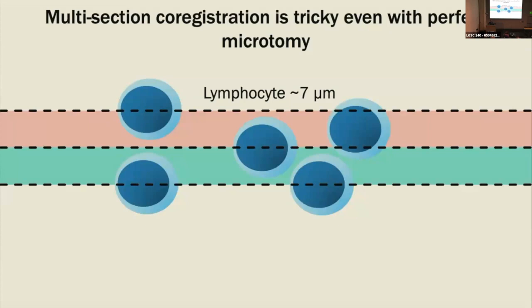Yeah, that's an interesting question. I don't have a great answer, but when I'm approaching a lot of this, I just look at it on H&E so I can see differences by eye. Then I ask how many I really think have a difference. Let's say I have two different biological behaviors, disease progressors and disease non-progressors. Somebody with DCIS, half of them progress to invasive tumors, half of them don't. Can I see a difference by eye between these two groups, and what are the numbers behind that? How many do I need to evaluate to see that?